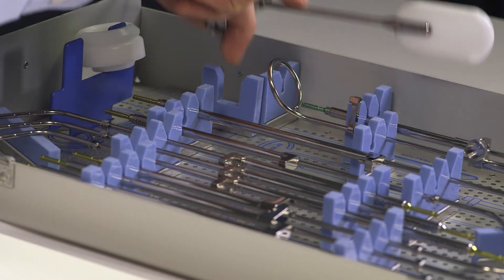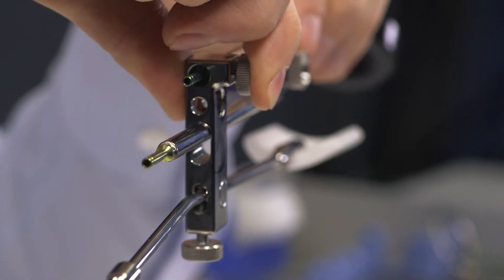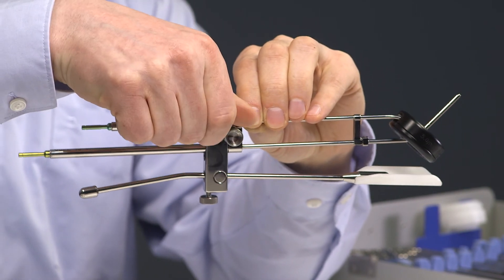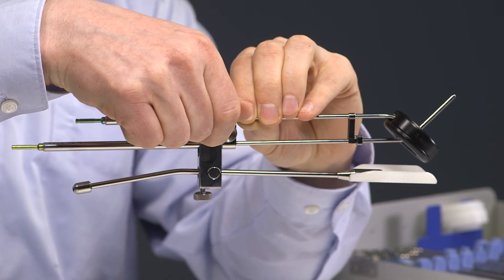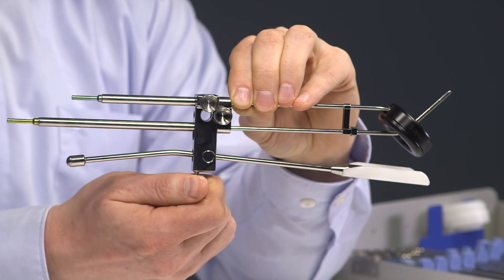In case the rectal retractor is used, it's simply guided over the tubes and locked into place with the side screw. The angle can be adjusted with the lower screw.